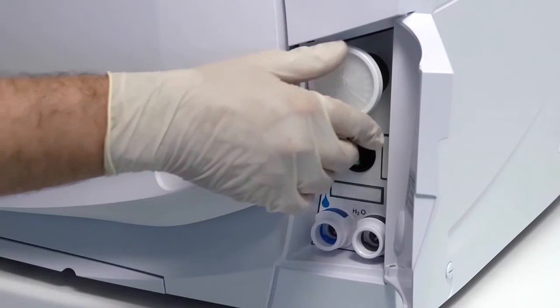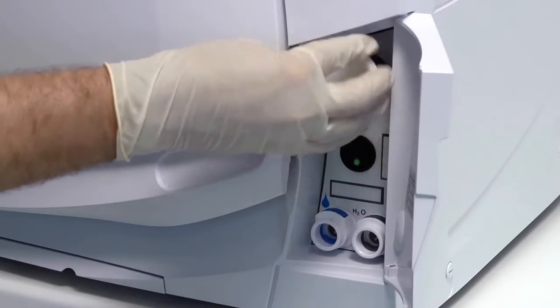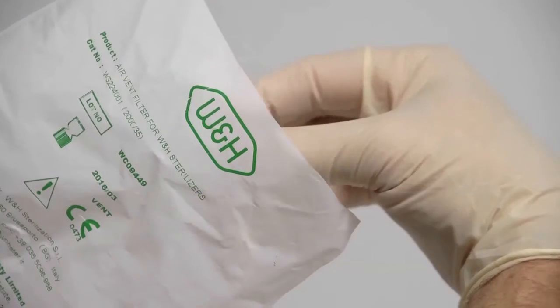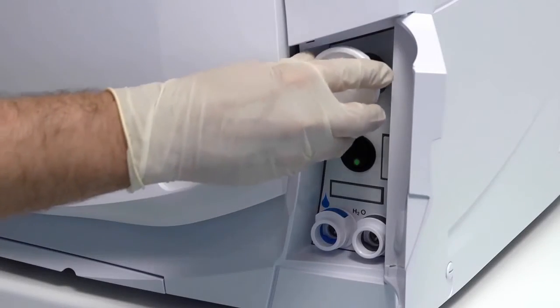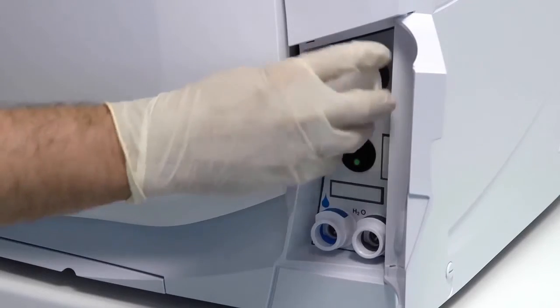To change your filter, unscrew the filter in a counterclockwise direction until it can be fully removed. The old filter can now be disposed of in a domestic waste container. A new filter can now be fitted. Remove the new filter from its packaging, insert it into the thread and rotate in a clockwise direction until it becomes tight.